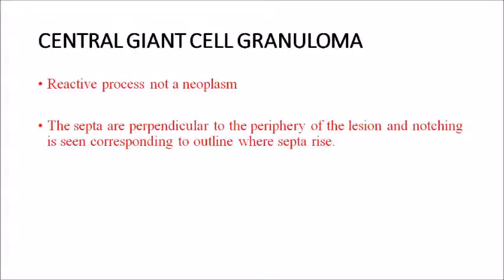Central giant cell granuloma is not a neoplasm but a reactive process. The septa are perpendicular to the periphery of the lesion, and notching is seen corresponding to the outline where the septa arise. The septa are perpendicular to the peripheral outline, and notching is seen where the septa rise.